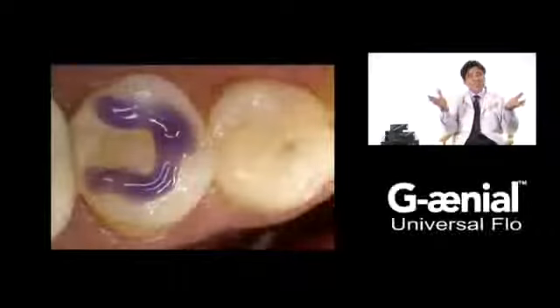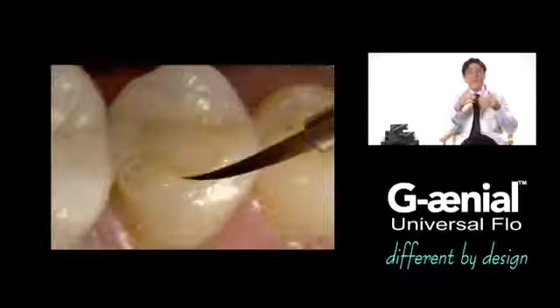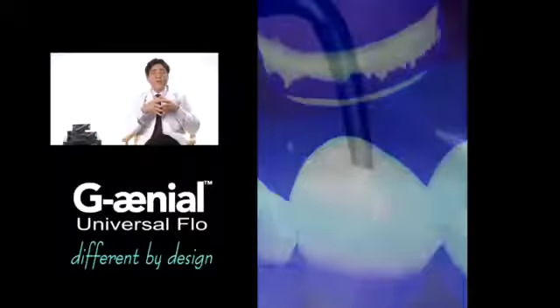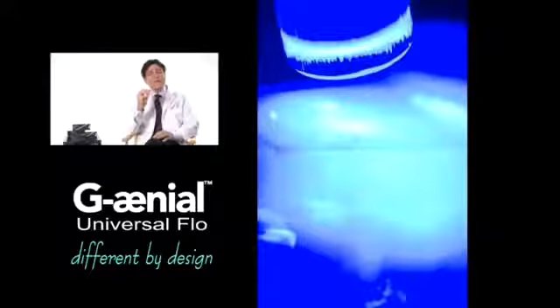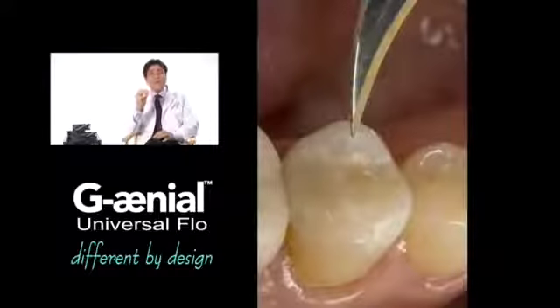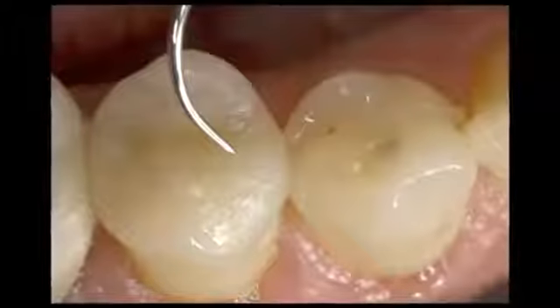Repeated flexural forces can also cause adhesive failure of adhesive restorations at the dentin resin interface, which can result in microleakage and partial or complete debonding of the restoration. A simple indirect direct technique can be used to restore anatomical morphology from wear or fracture using these next generation flowable materials.